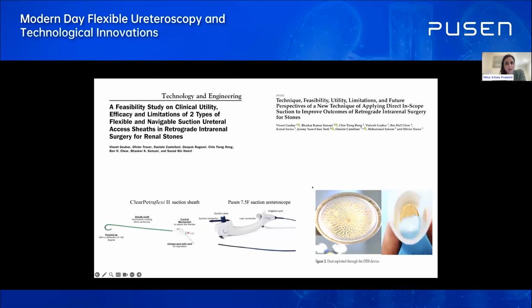Thank you very much, Bhaskar, for sharing with us this very interesting video. I have a question for you. Do you have any experience with bleeding after too much suction during flexible ureteroscopy? And what do you do if you have some bleeding during the procedure?